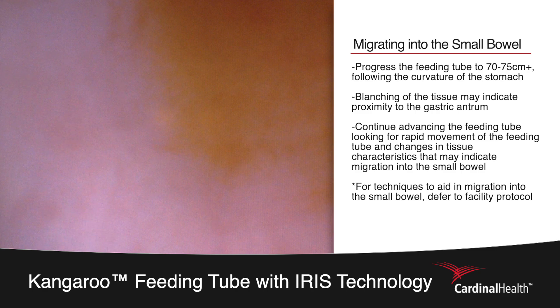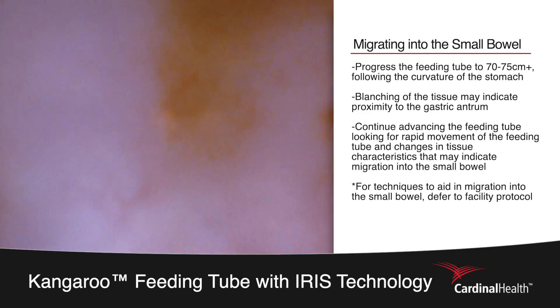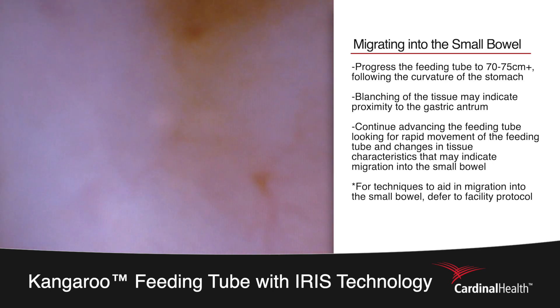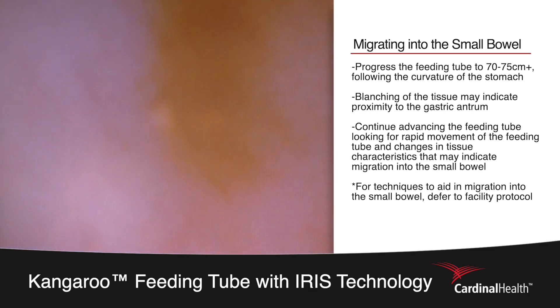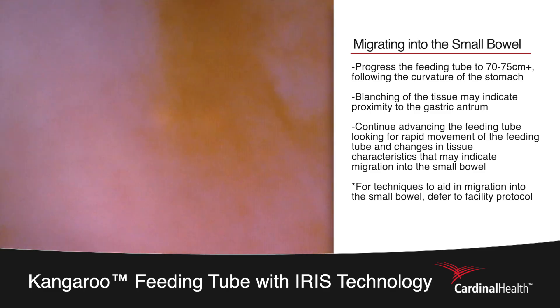As the placer continues to progress the tube to the 70-75 centimeter mark, you may visualize blanching of the tissue as the tube approaches the gastric antrum. At this point the placer has progressed the tube to the 70-75 centimeter mark down at the base of the patient's stomach.